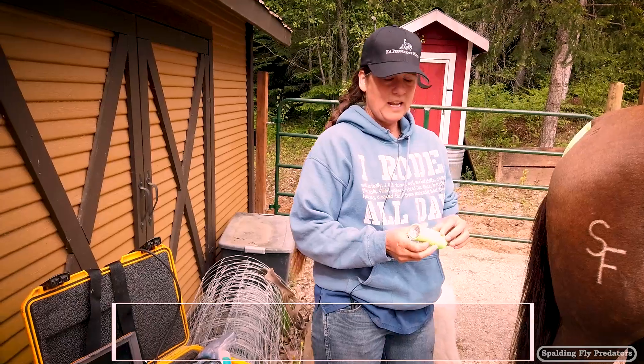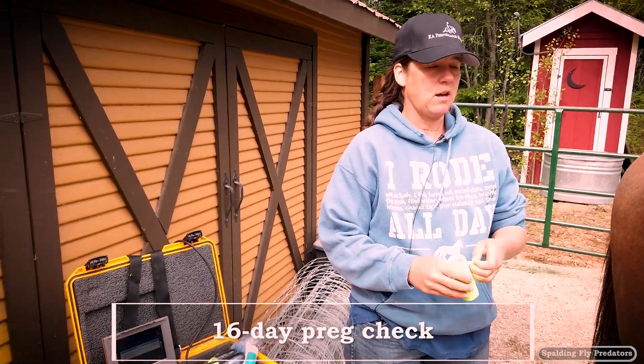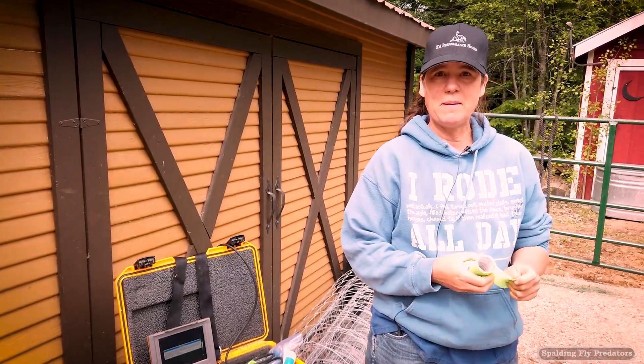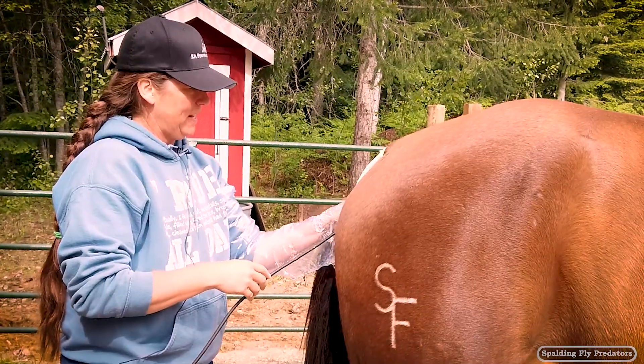You're on the road with Dr. Jenny. Today we are preg checking this mare. She was bred 16 days ago and we're gonna check and see if there's a baby inside. Okay little girl, let's see if you will hold still for this.